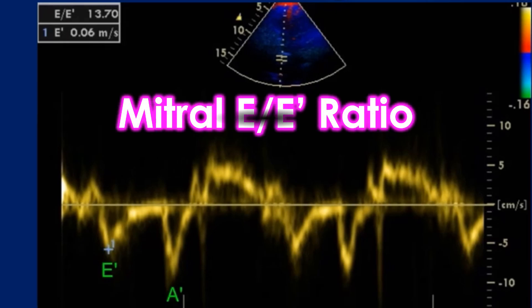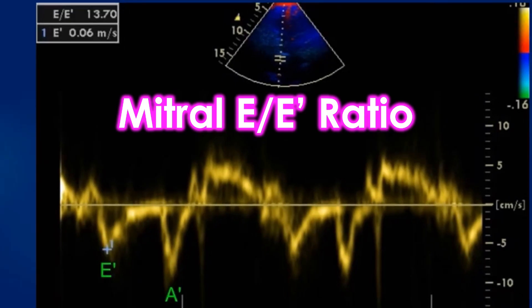Mitral E by E' ratio on echocardiogram is an important indicator of left ventricular diastolic function. It can be used in the presence of atrial fibrillation when E by A ratio is not available. Tissue Doppler echocardiography showing measurement of Mitral E by E' ratio for assessment of diastolic dysfunction.